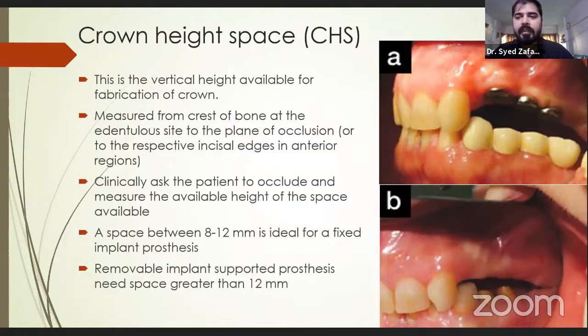Before placement of implant, mostly when a patient comes to you and demands replacement, sometimes patients say I want an implant, and the dentist thinks, oh, now it is time to earn money. Without examination, without assessing, they place an implant, and after this, this picture comes. Will you place an implant in this type of case?